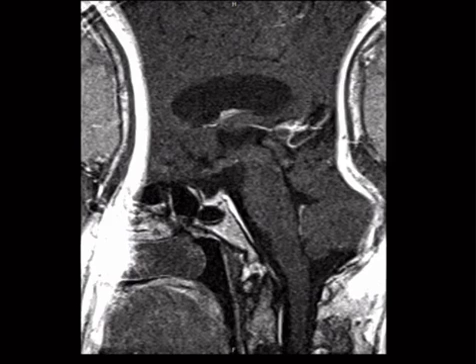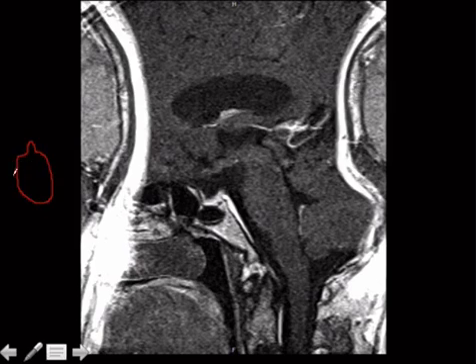Now notice that this occurs in the phase encoding direction. Now remember that phase encoding is a contributor to table time, so you always try to pick the thing that has the shorter dimensions, because that's going to matter. So if we look at a head, here's a nose. If you did slices in this direction, that would take you longer.